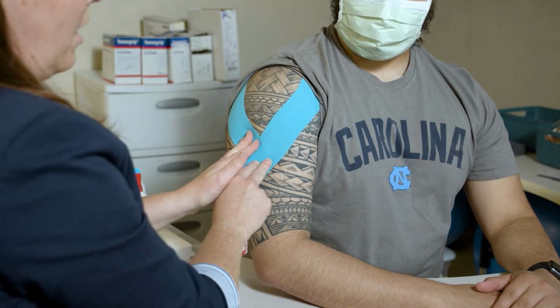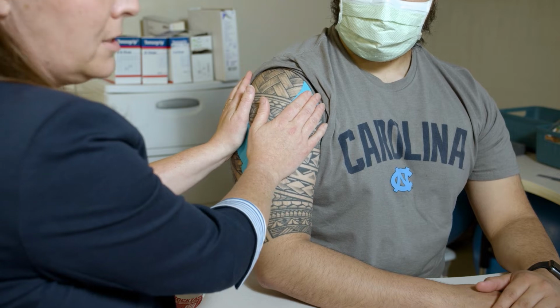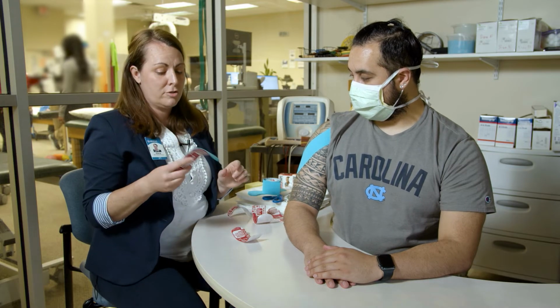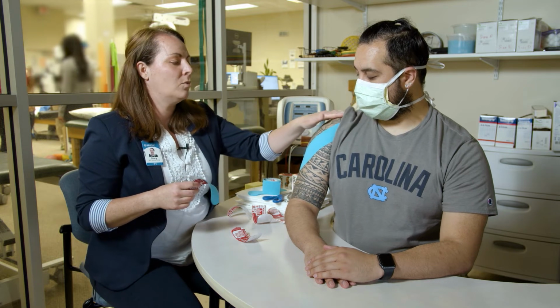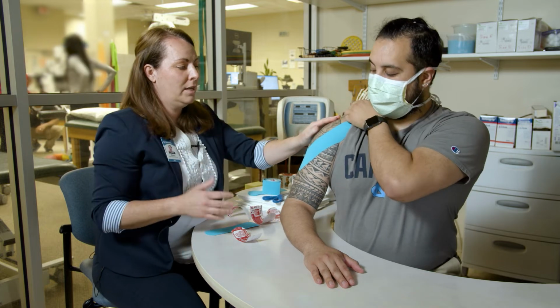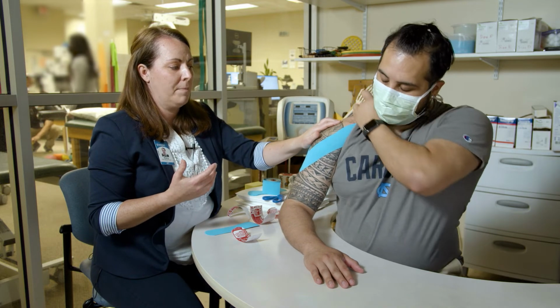So we're doing 2 around the shoulder here. These are just stabilizing strips. You just apply them down. You don't have to pull them. Your compression strip or decompression strip is the one that we're going to be using the most to help decrease pain. So Sonny, we'll say, has a little bit of pain up here at the top of the shoulder.